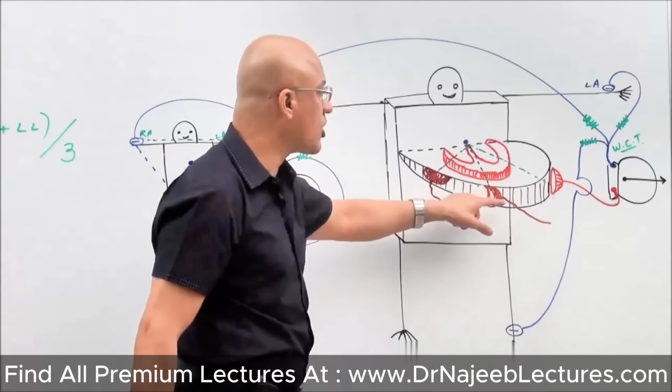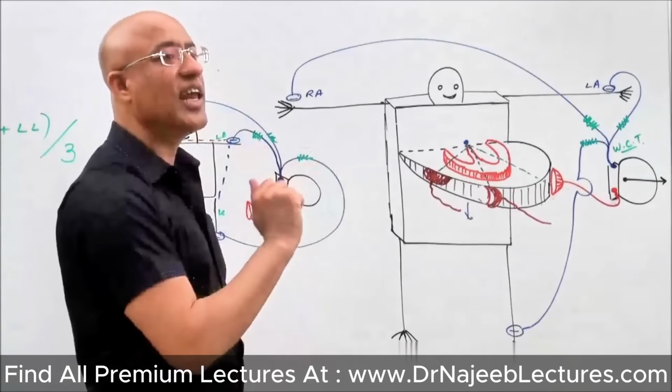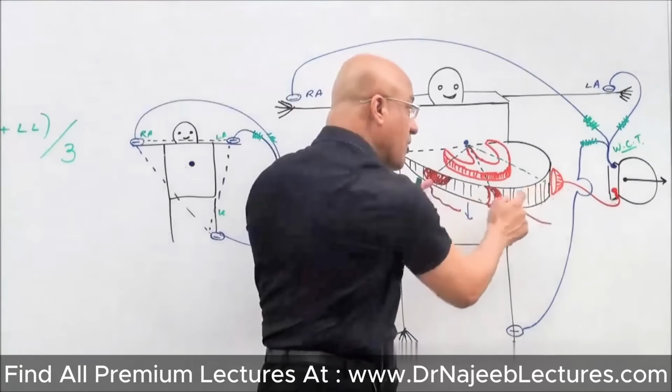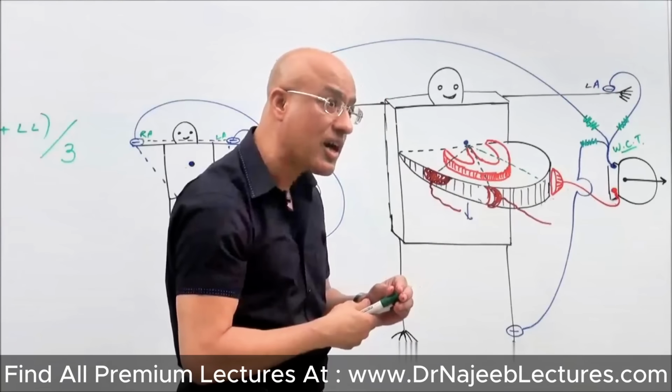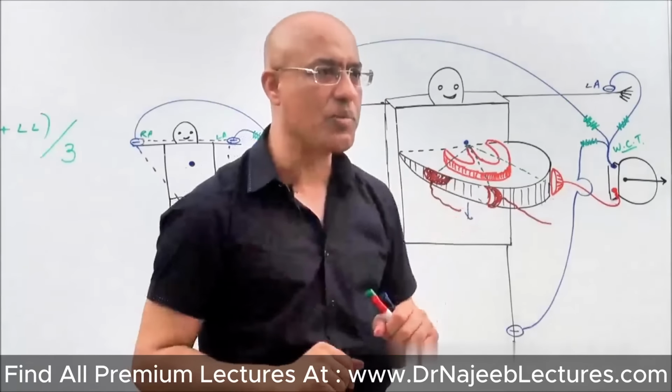The positive pole, or exploring electrode, you can change in position to look at the electrical activity of the heart from different angles. You can look at the electrical activity of the heart while it is being transmitted along the horizontal plane.